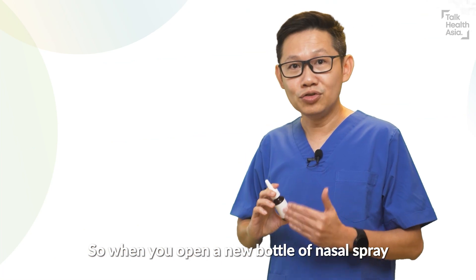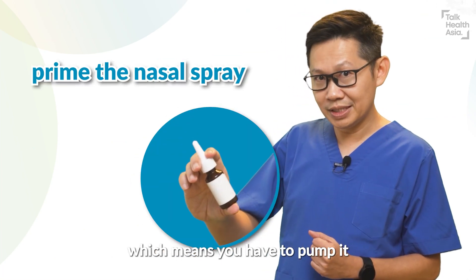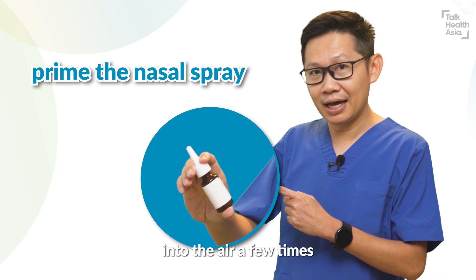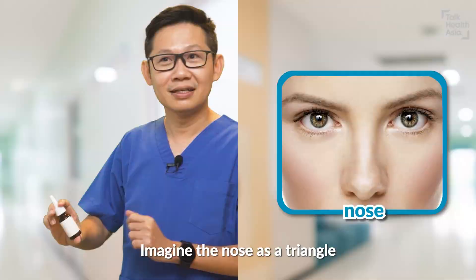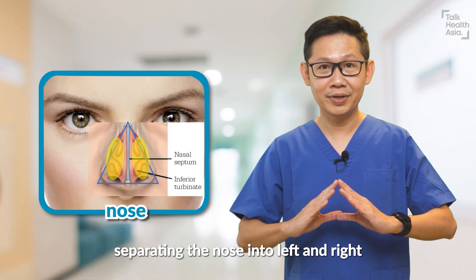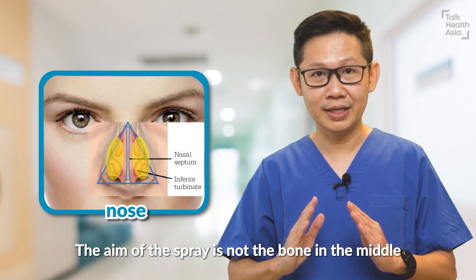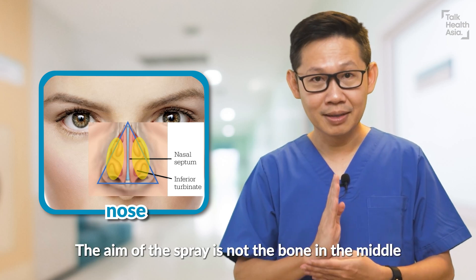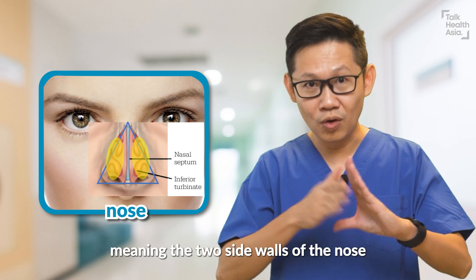When you open a new bottle of nasal spray, you have to prime it — which means you pump it into the air a few times until you get a nice proper mist. Imagine the nose as a triangle with the bone in the middle separating the nose into left and right. The aim of the spray is not the bone in the middle, but the two lateral walls — meaning the two side walls of the nose.